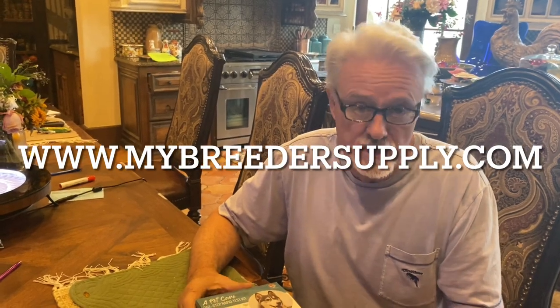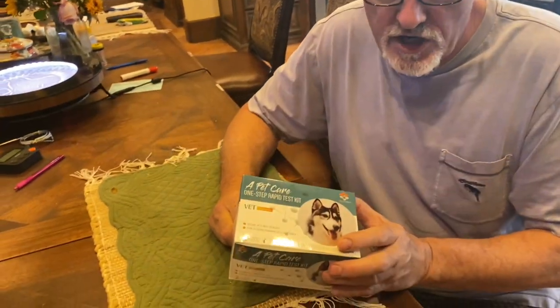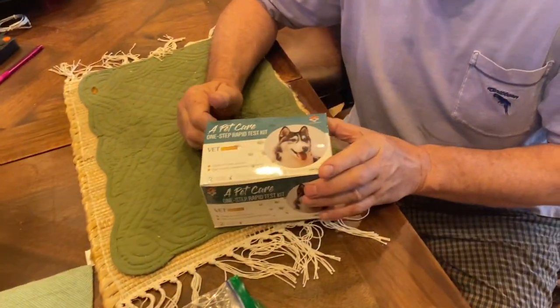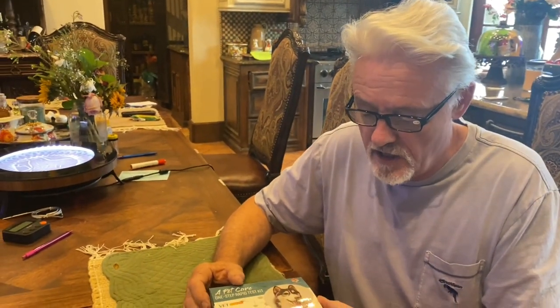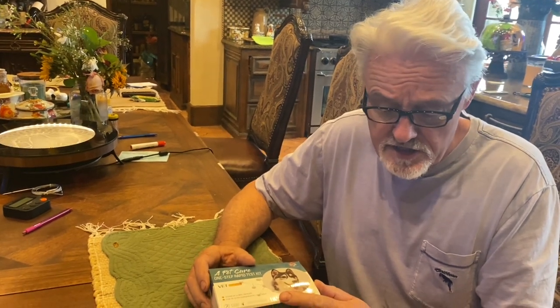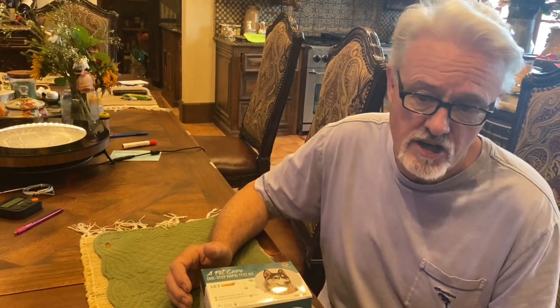We are going to do a Giardia test. We sell four different tests, and this one is for Giardia, which is a parasite that gets into the guts of dogs. It's very common for puppies and relatively easy to treat. It's not so easy to detect — you can quite often go to the vet and the vet says they don't see any Giardia, when in fact Giardia is present.